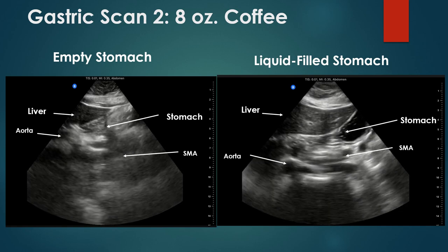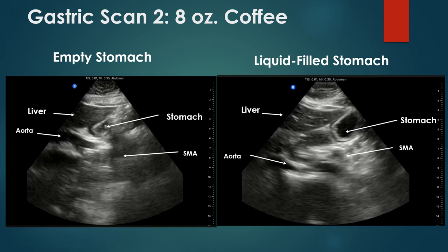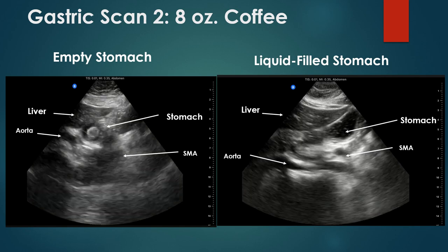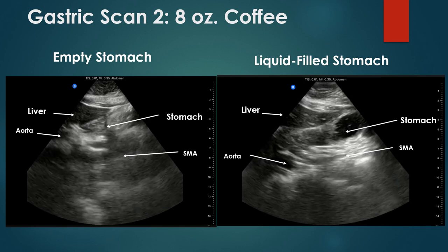And so I guess the thing to do here is to qualify it, say, hey, you know what? It doesn't look very full. It looks starry night. What's your NPO time? And what have you had to drink? And move along from there.